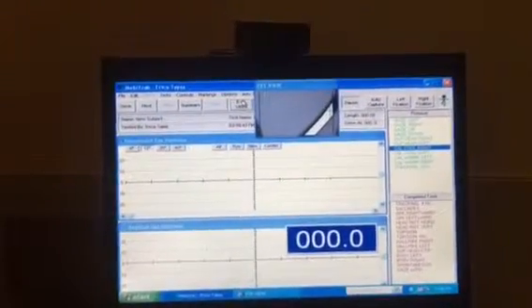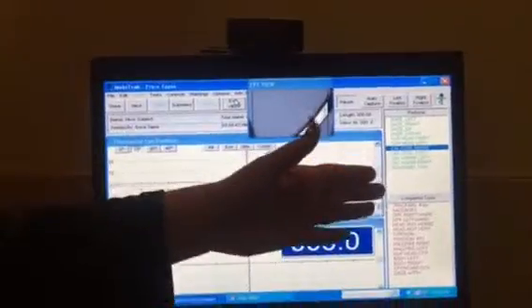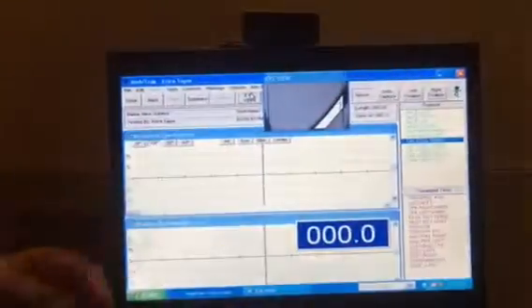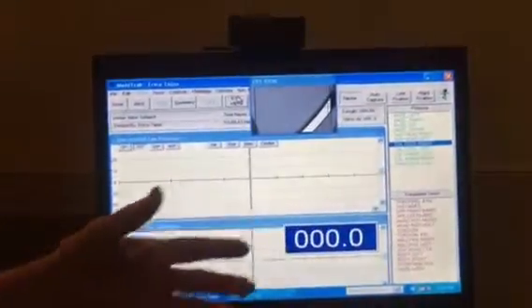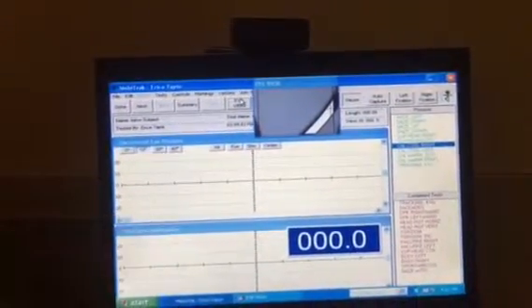And you do that on all 4 sides. They rest a few minutes between each test. During that time, you go back and you're marking the test. So you see if you're really screwed up on something that needs to be repeated. And by the time you've done the 4 calorics, you've already marked these tests because you're going to be faster doing it. What's easy to mark? Torsion's easy to mark. Gazing is easy to mark. They'll all be easy to mark.